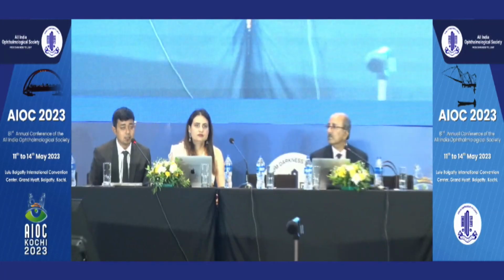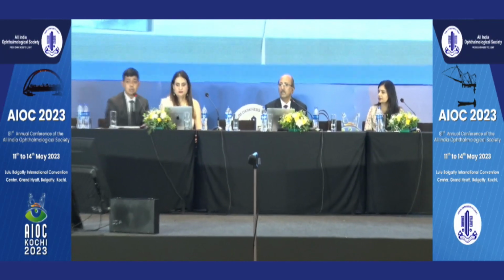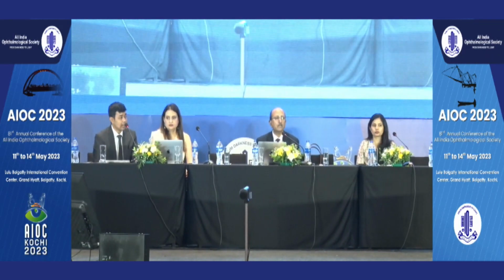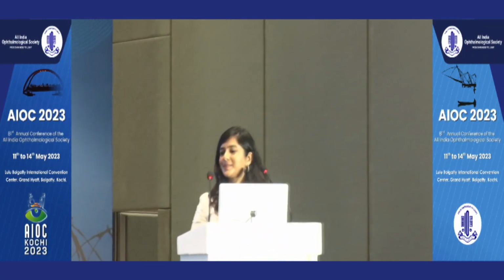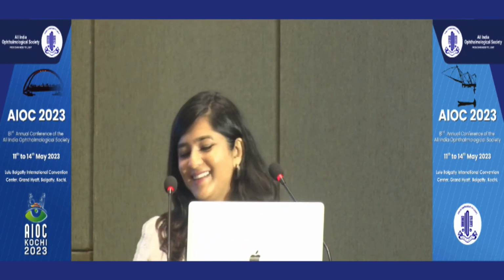We have almost stopped even looking at the ASCRS or other calculators nowadays, and if you have the TK with you, the Barrett True-K TK works even better, and we are able to achieve excellent results with them. You are even able to have the confidence to implant multifocal IOLs in many of these patients because the biometry is spot on. So up next we have Dr. Supriya Sri Ganesh, who's going to talk about managing post-operative refractive surprises, a surgeon who's just as talented as Dr. Sri Ganesh, and we look forward to hearing from her.